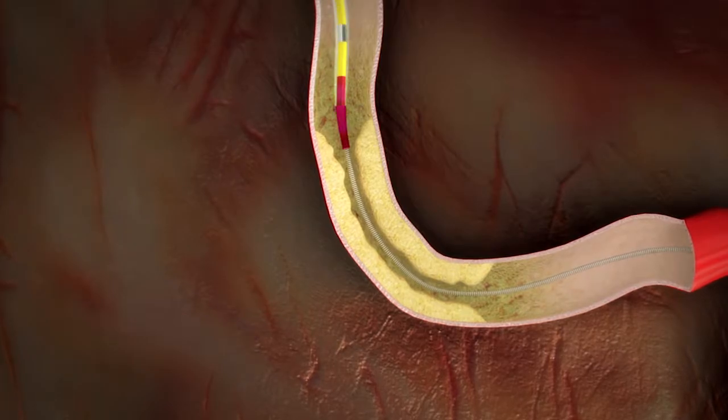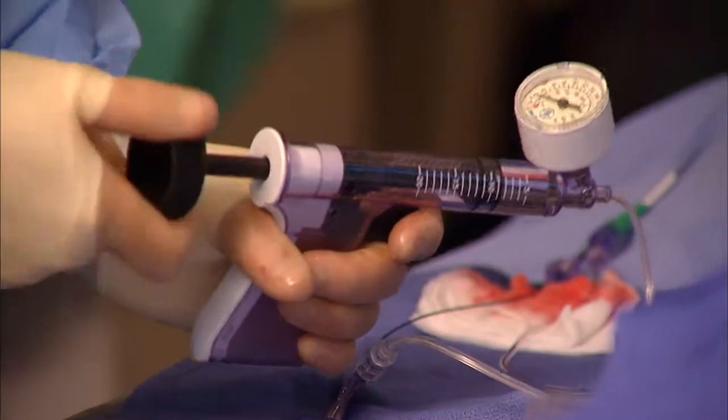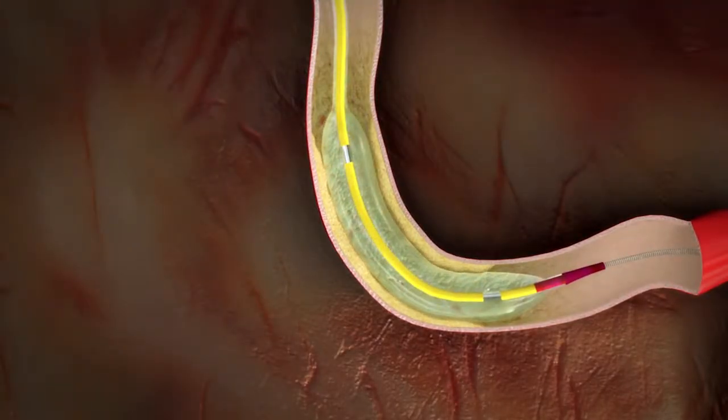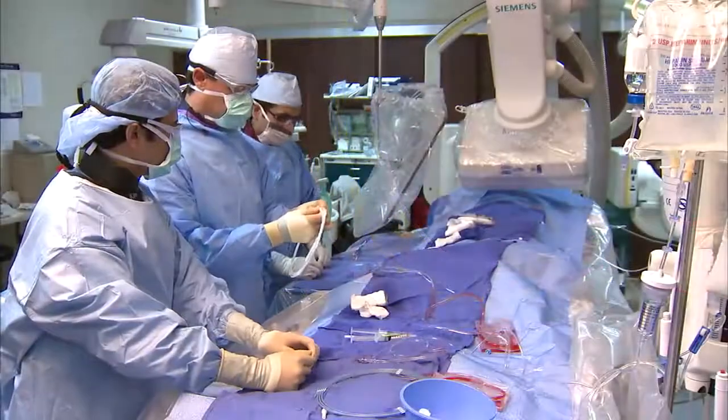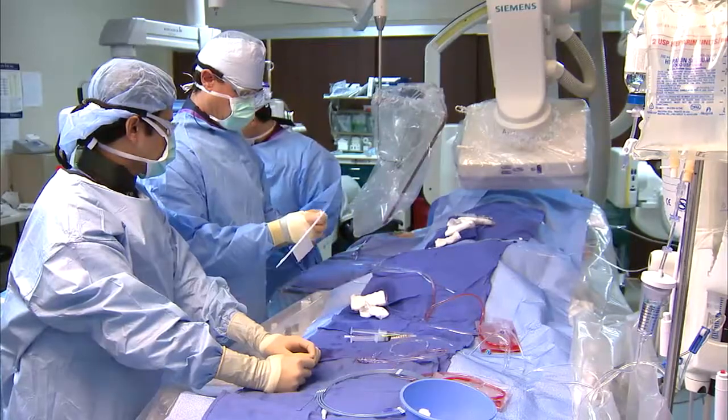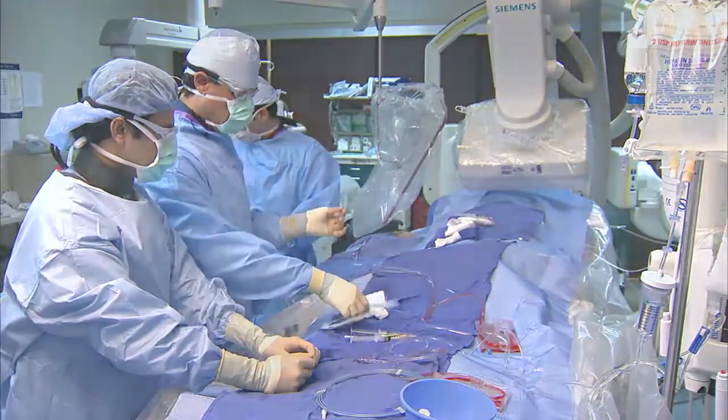Once it reaches the blockage, the balloon is carefully inflated to flatten the plaque against the artery wall. It's normal to feel some mild chest pain when the balloon is inflated. In some cases, balloon angioplasty alone may not effectively open your blocked artery, and your doctor may recommend placing a coronary stent at the site of the blockage.